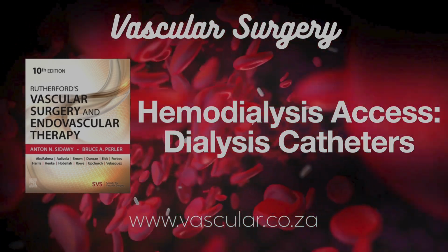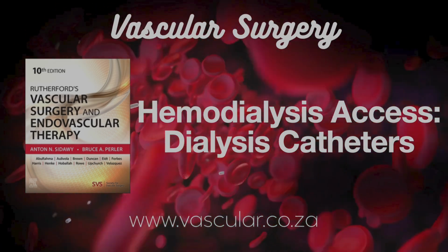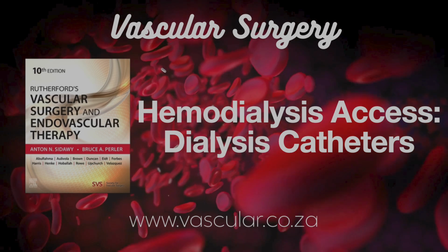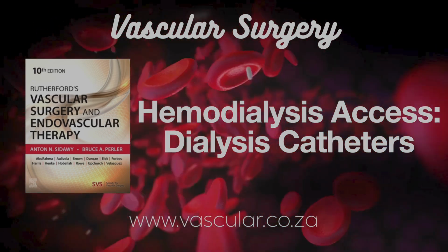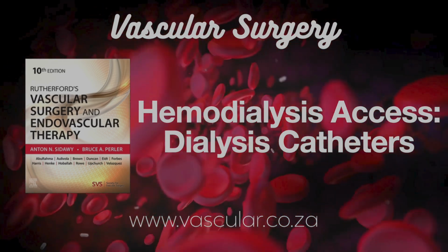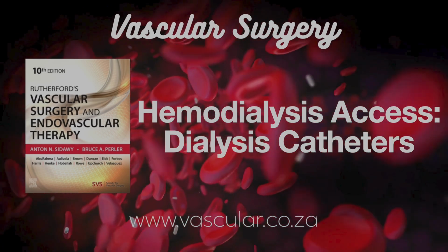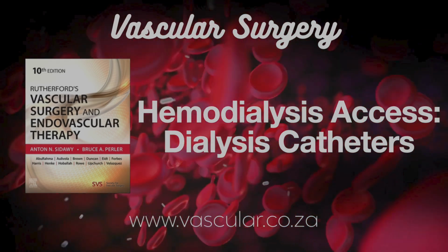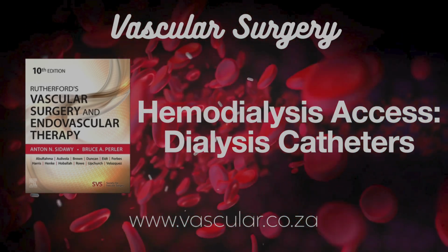So if you need a better look centrally, then we move to more advanced stuff. Magnetic resonance venography, or MRV, is one option. It's very good at finding blockages or narrowings in those central veins. Any issues with MRV? Well, the contrast agent, gadolinium, can be a problem for patients with really poor kidney function, GFR below 30. There's a rare but serious risk of something called nephrogenic systemic fibrosis. Oof. Okay. Is there an alternative? Yes, thankfully. There's an iron-based agent called ferumoxytol that can be used for MRV instead. It avoids that risk and still gives us good images.